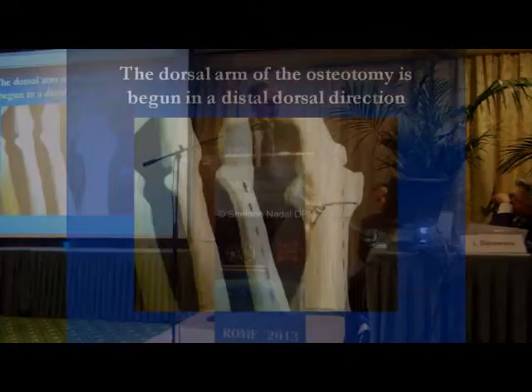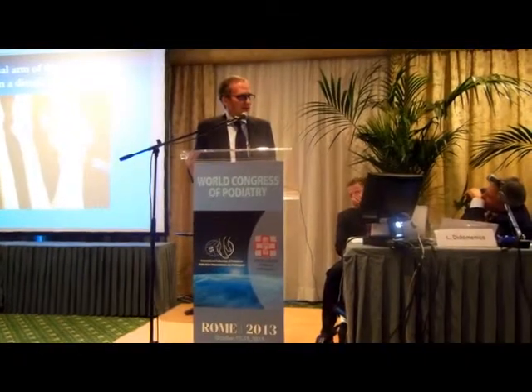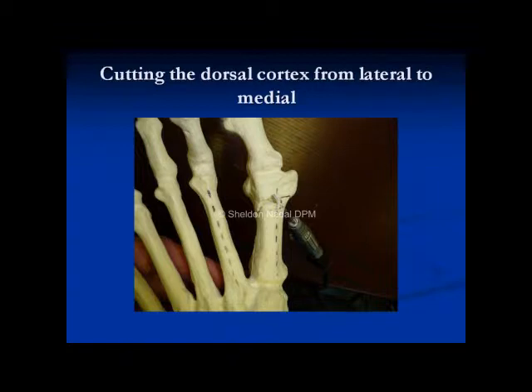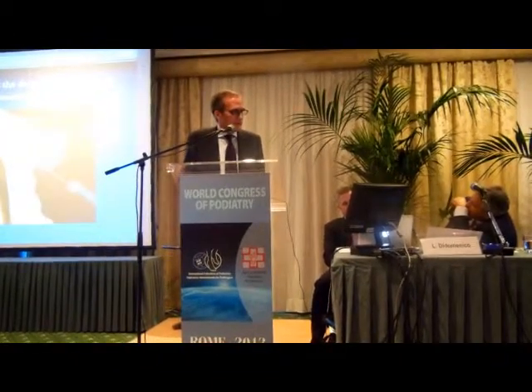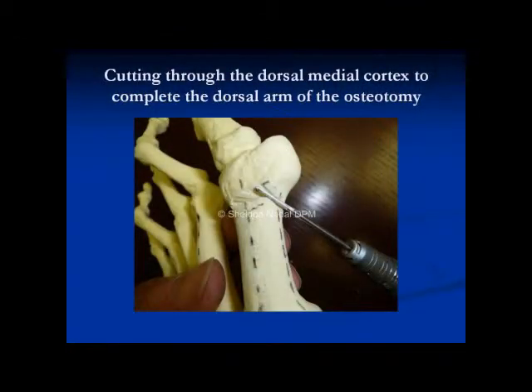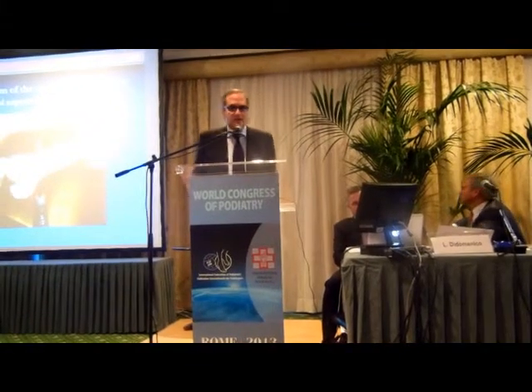And here we're starting the osteotomy. We're pivoting from the original osteotomy site, and we're going in a dorsal distal direction, cutting the dorsal half of the lateral cortex. And then we continue the osteotomy across the dorsal cortex from lateral to medial. Again, we're pivoting through that osteotomy site, through the original failsafe hole. And then we finish the dorsal cut in the dorsal medial portion of the cortex. So we've now completed half of the osteotomy.